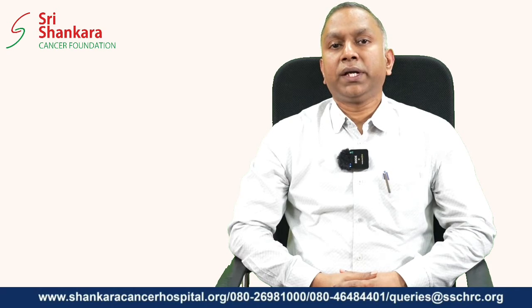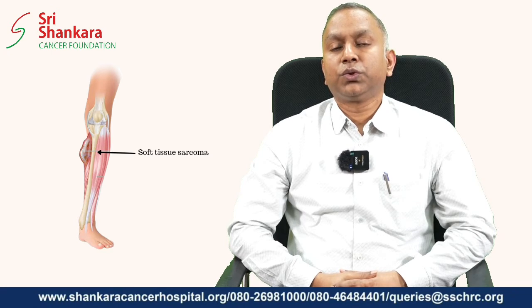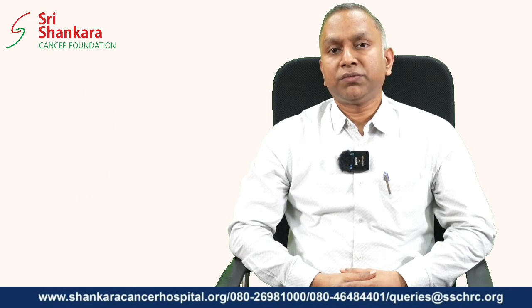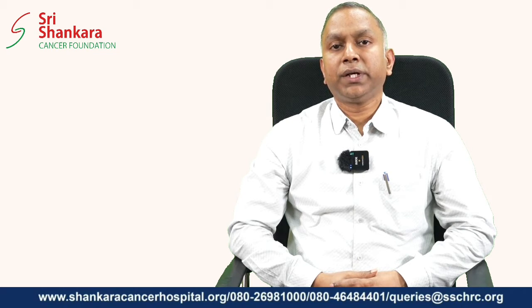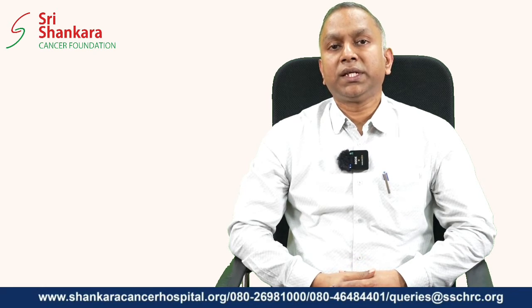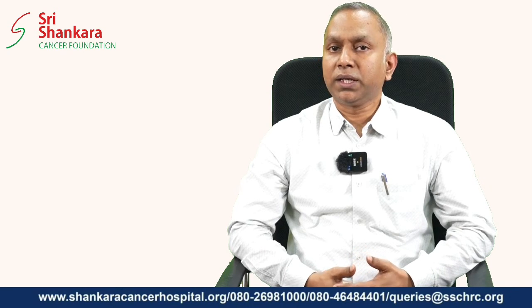The other area where interstitial brachytherapy can be very effective is soft tissue sarcomas. Soft tissue sarcomas are tumors that generally arise in the muscles and the connective tissues. The mainstay of the treatment is surgery. Once the surgery has been done, surgeons will involve the radiation oncologist to put the needles into the tumor bed, as we call it. The surgeon would have removed the entire tumor. In the area that has been removed, we will place the needles in such a way that they are equidistant, and the entire procedure will be done under anesthesia.